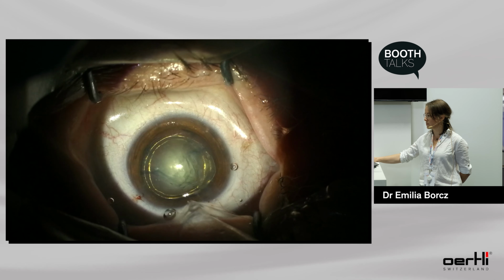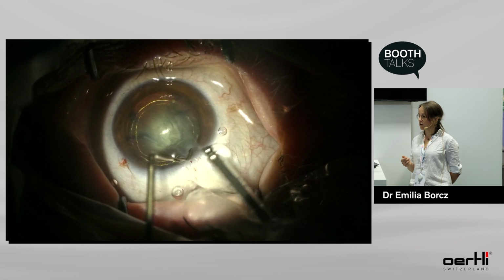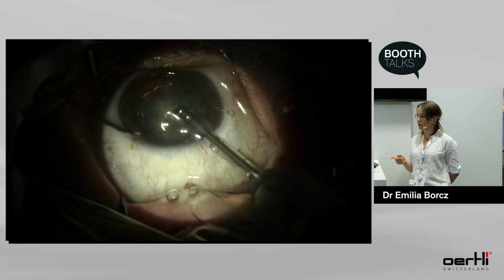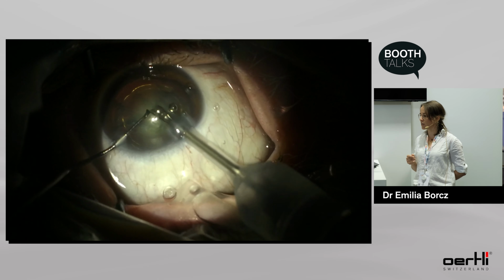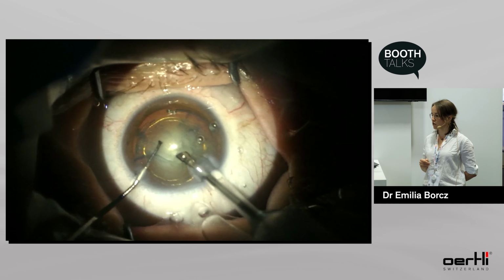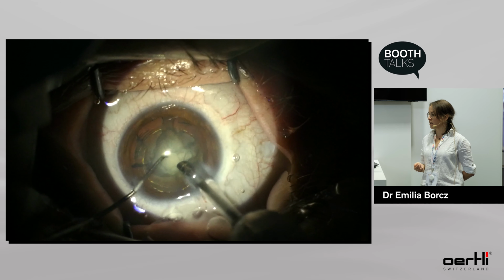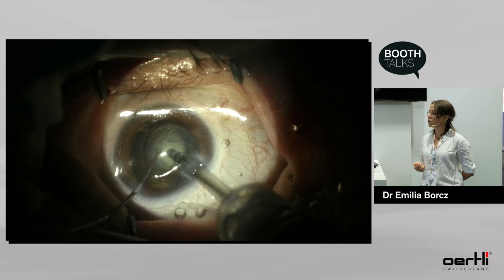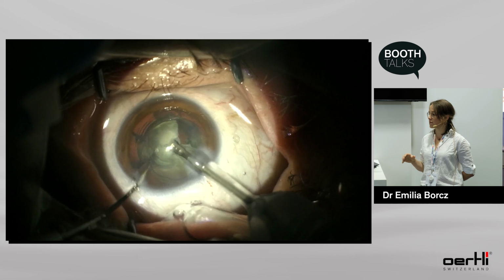And the last one is a mixture: the central part was hard, and the cortical masses were very soft. I performed a nice hydrodelineation here. I have two golden rings, but for sure hydrodissection is also performed. I check the sleeve, perform pre-phaco again, and with very nice holdability, you will see here I catch the central part.